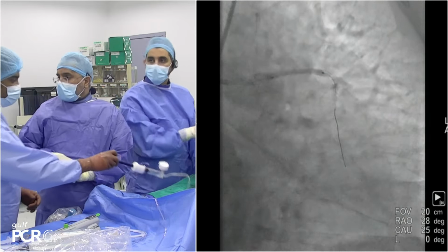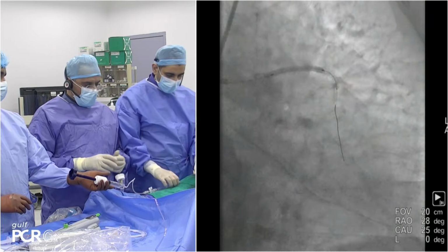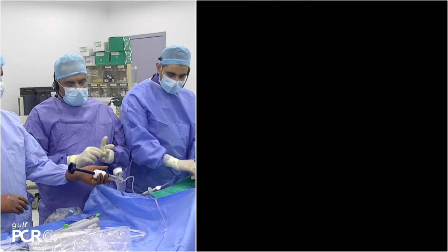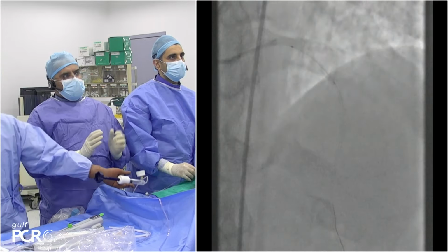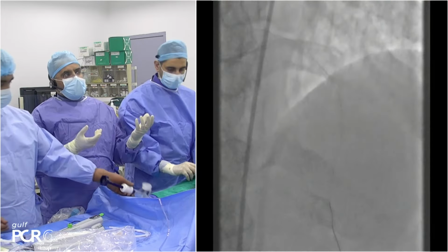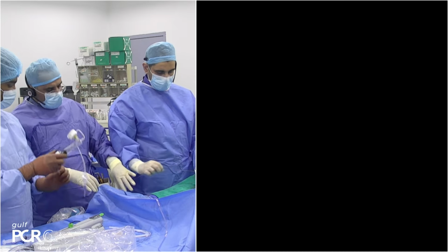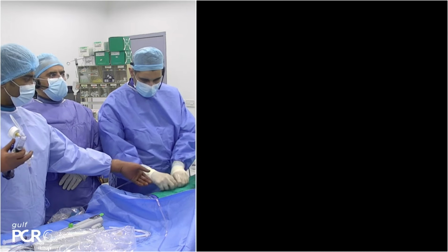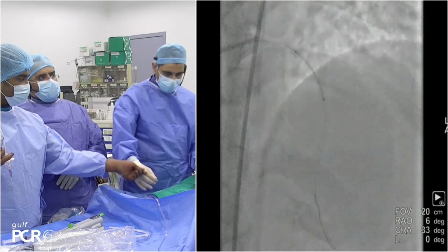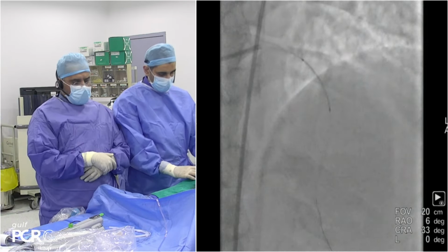Khalid and Abdullah, you hear the comments from Julio. Yes, we did hear it. We already implanted a stent. It's opening fully, no waist. We took different angulations to make sure it's symmetrically inflated. What size of stent and what size and length did you choose? Post-dilate the proximal. Yes, we sized the stent based on the distal segment, which is 2.5. And we are going to optimize the proximal part with a 3.0 NC balloon based on the size we have. And then we take another run of OCT.